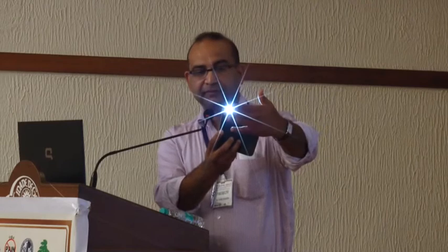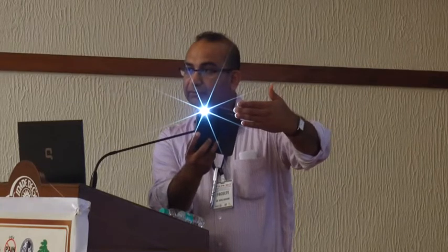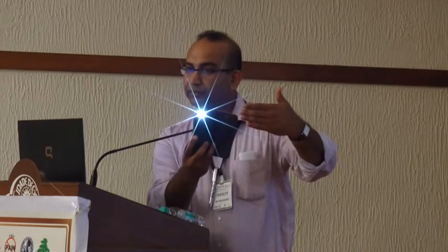And the shadow is something like, when the ultrasound hits the bone, it will cause a shadow. Now, I'll just explain it. It's really important, that's why I'll explain it. So if, say, this is the light I'm shining, it won't pass through the bone, but if the light is here, that will go through in between the bones, and that will, of course, give us a window. So this is a shadow, and this will be the window.